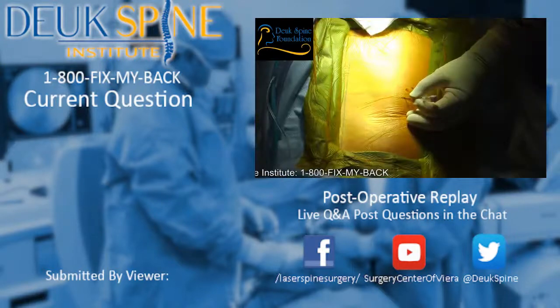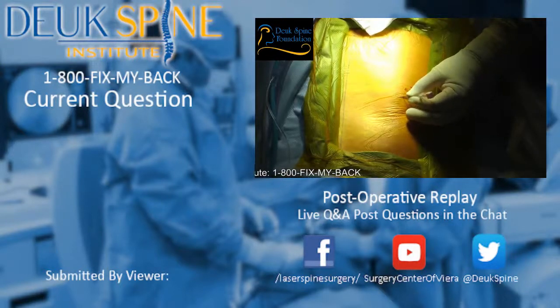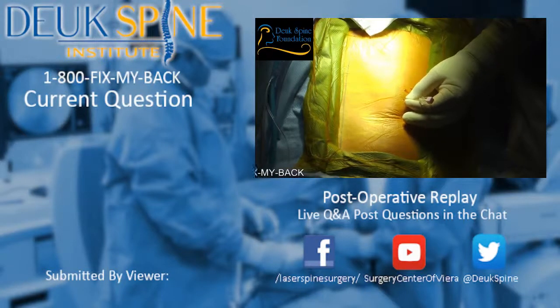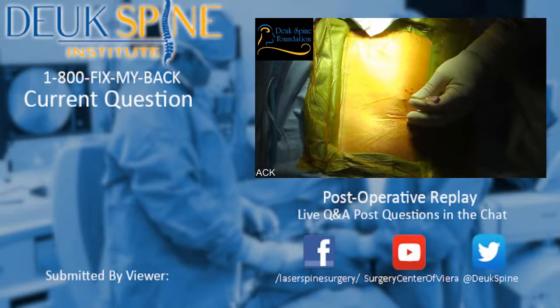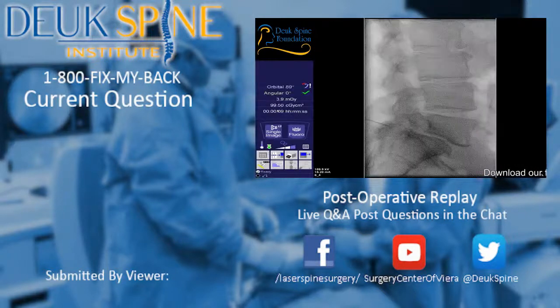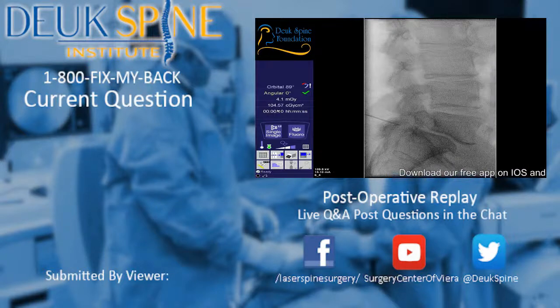Most spine surgeons, all other spine surgeons for that matter, have to make a hole in the spine to get to the disc herniation. We don't have to do that with the Deuk Laser Disc Repair. Any endoscopic transforaminal surgeon, a surgeon that uses an endoscope and goes through the neuroforamen like I did, none of us have to remove bone, okay? All of us have that advantage.